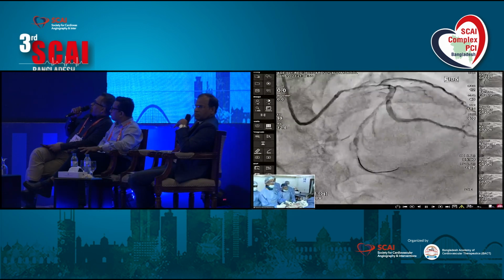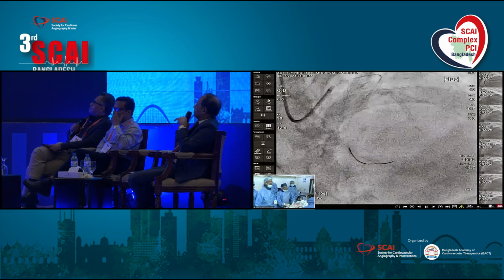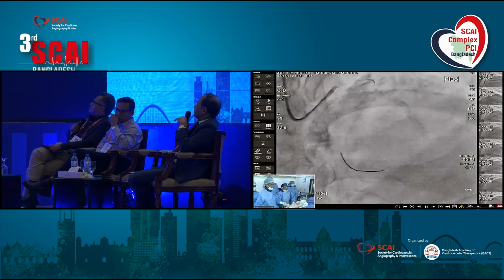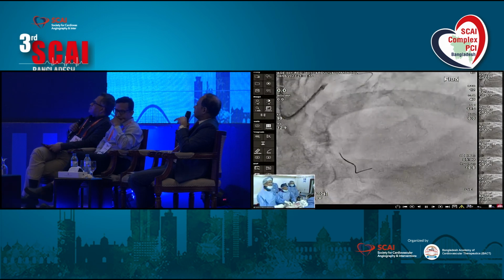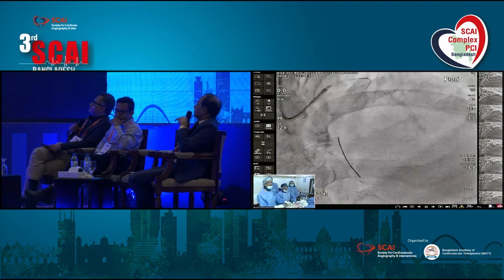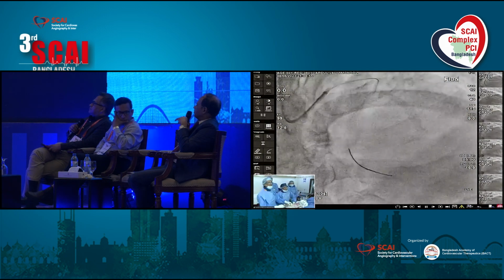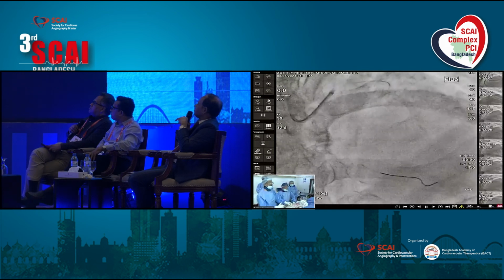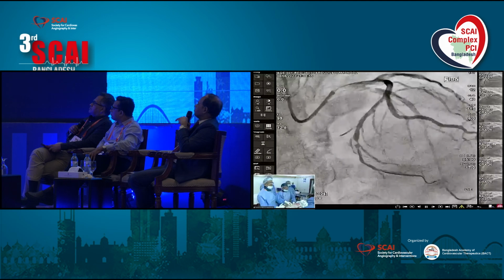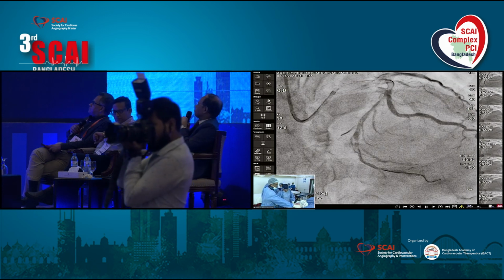Sir, can you go for stenting here? LPDA is a good branch. LPDA is always very much valuable in a case of dominant vessel with non-dominant RCA. What is the wire? That is the floppy wire. Okay, we have four more minutes. So I think it is easy to tackle it.